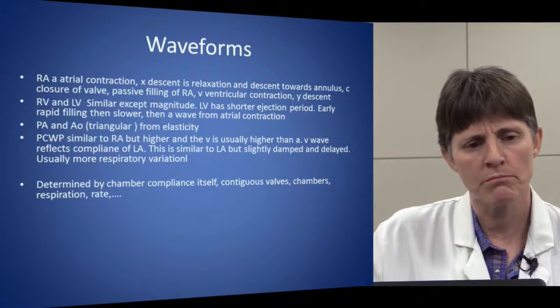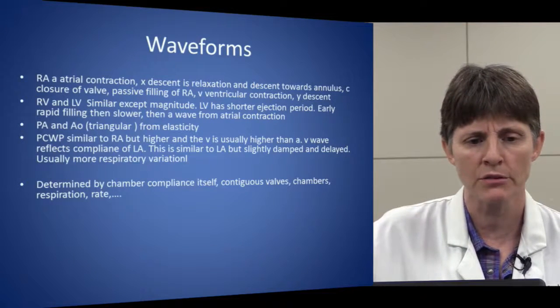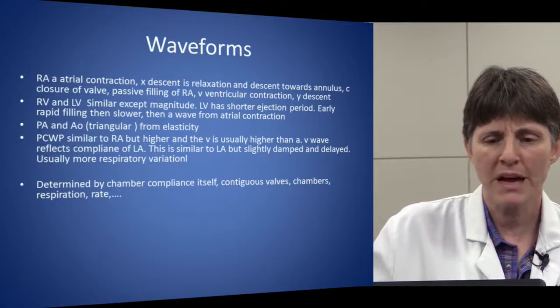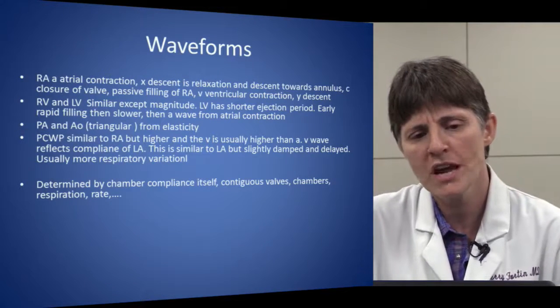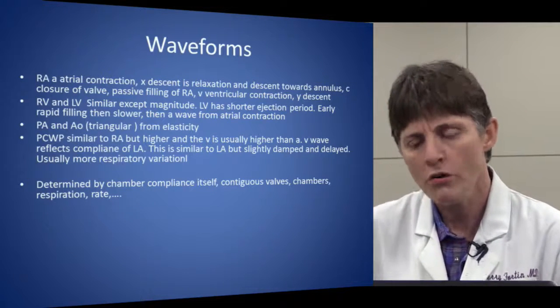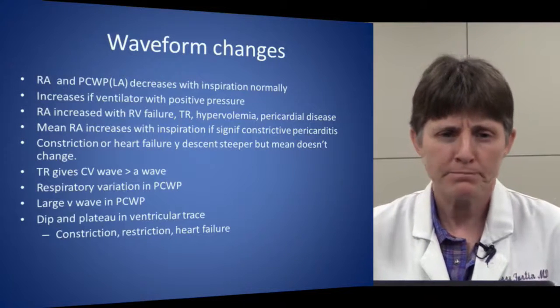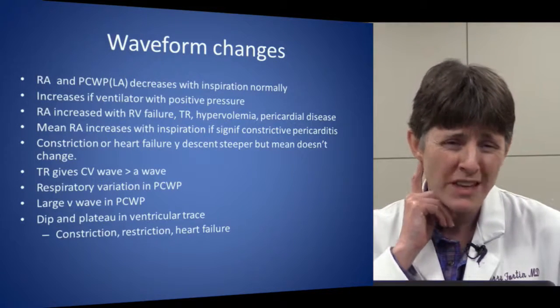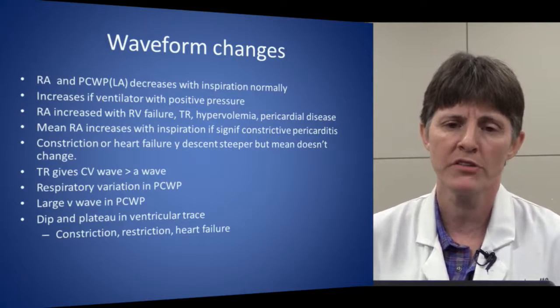Again, I don't want you to remember or memorize any of this, but for you to look through and understand. The chamber compliance itself, whether the valves above or below it, and the chambers above and below it, as well as heart rate and respiration, all are going to play a role in how things look. Normally, we should see a decrease in pressure during inspiration.